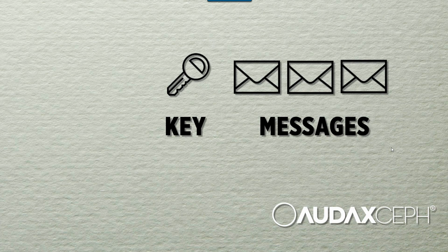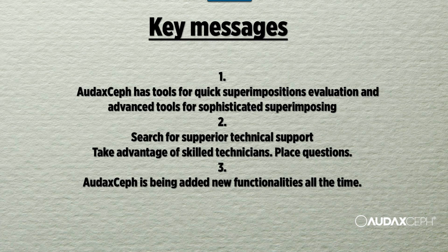I want to stress 3 key points that are important for your orthodontic software in correlation to superimposing. First, AudaxCeph has tools for A, quick and easy superimposition, and B, tools for manually superimposing and evaluation of treatment of growth changes. Second, very important thing is technical support.